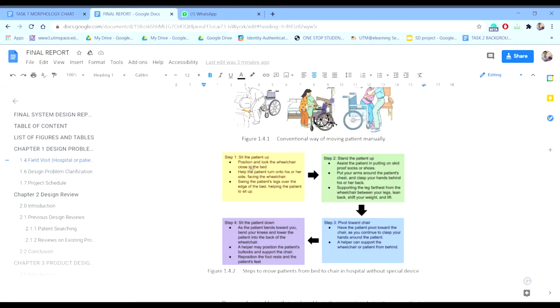The first step is to sit up the patient. The second step is to stand up the patient. The third step is to move the patient toward the chair and sit the patient down. These are the four main steps.